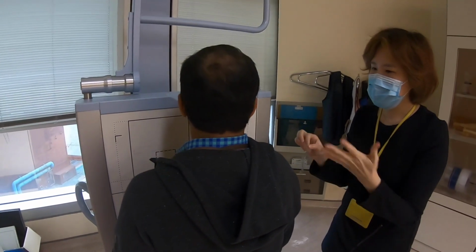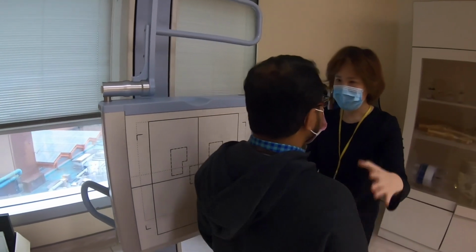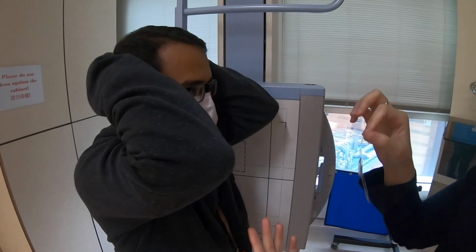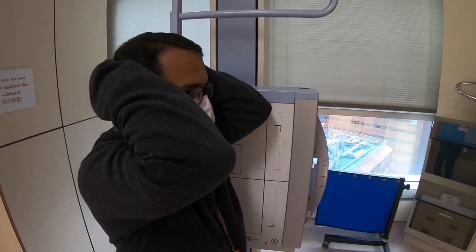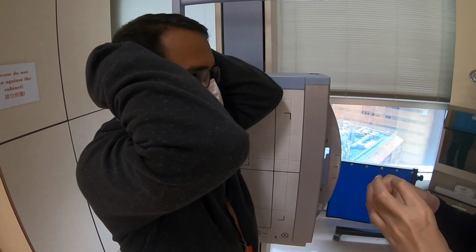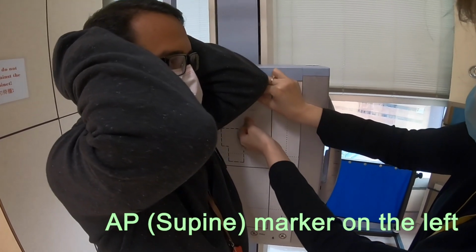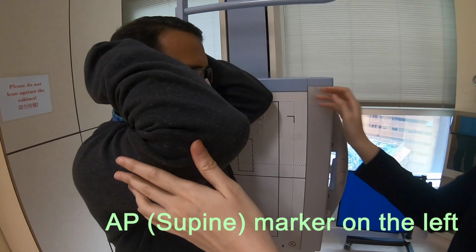So let's take chest as an example again. So please hold your hand like this. Let's move a little bit. Yeah. So this time we're going to put a supine marker for this patient. And again, of course, we're going to indicate the side for this patient. So if it is a left lateral chest, we're going to put a left marker, but in a supine position for this one, okay, like that.